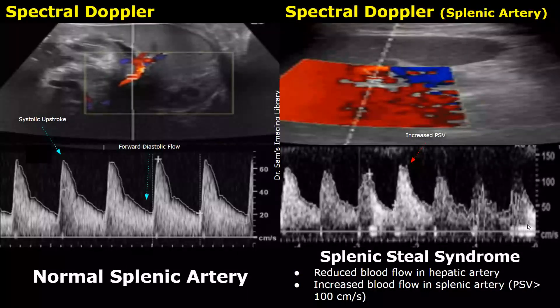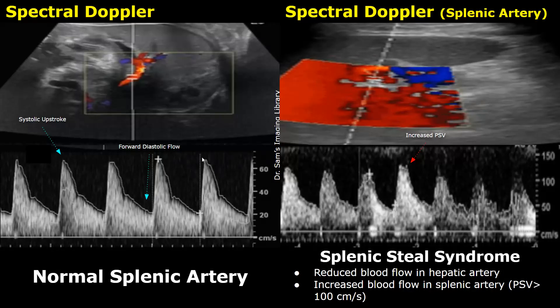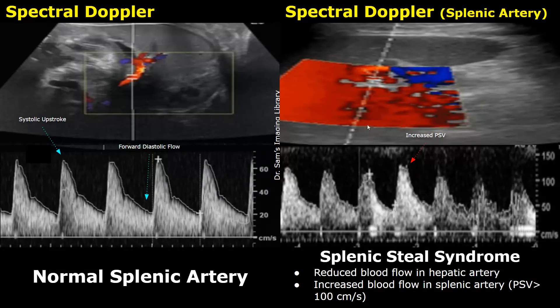This image shows a normal spectral Doppler waveform of the splenic artery: there is a sharp systolic peak followed by forward diastolic flow. The image on the right shows the spectral Doppler waveform of the splenic artery in a case of splenic steal syndrome. The PSV is increased — it is almost 150 centimeters per second — whereas in the normal image it is just over 60 centimeters per second. Flow is increased in the splenic artery, as if the splenic artery steals the blood from the hepatic artery.